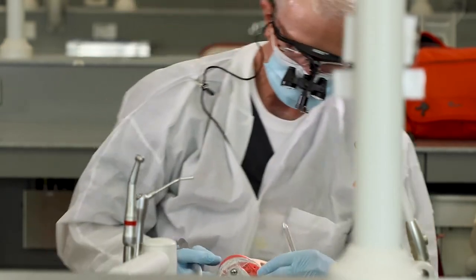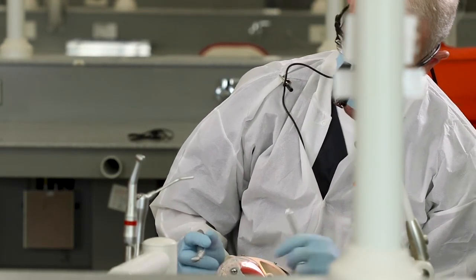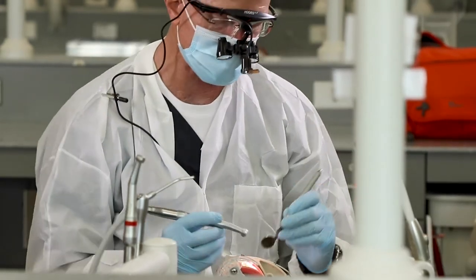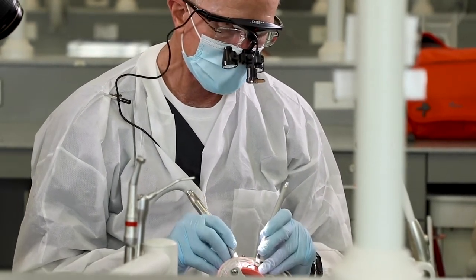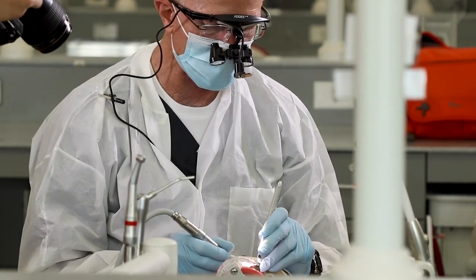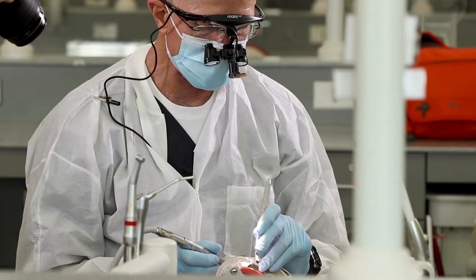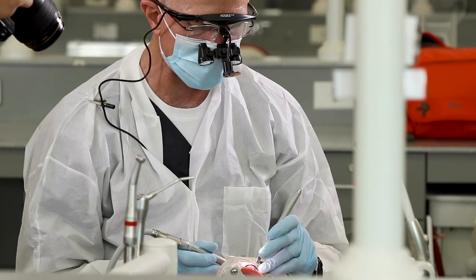Our occlusal reduction is almost done. I can see a couple of places I want to just dress up a little bit, and most of that will actually be dressed up when we do our rounding — so I'll save that till the end. We pretty much have the occlusal reduction done now. Next we move to axial reduction.